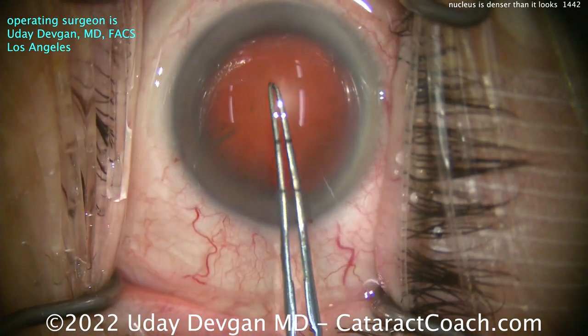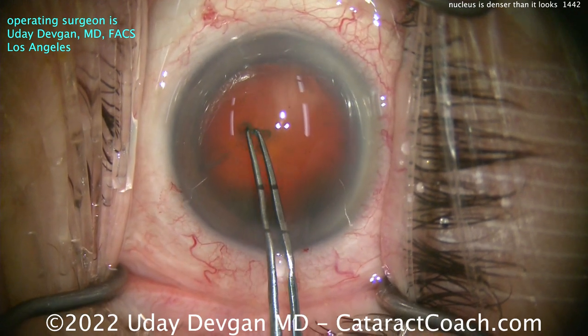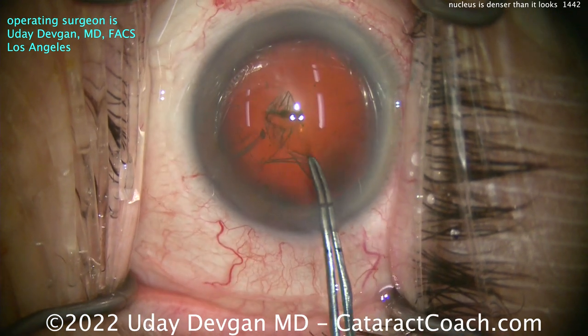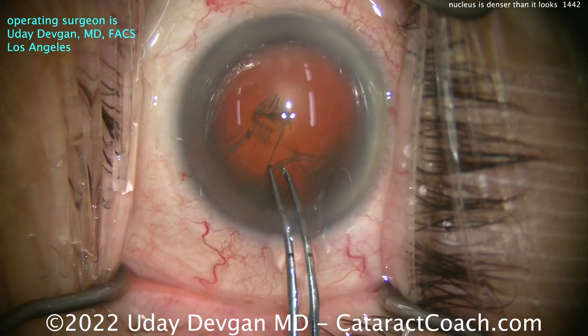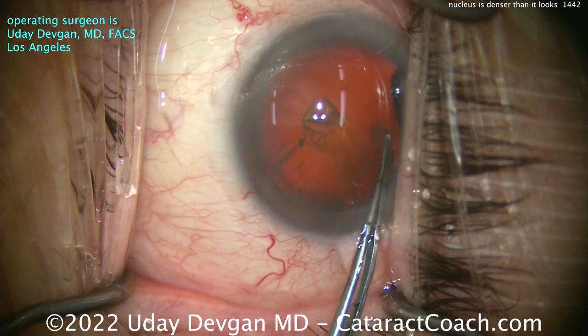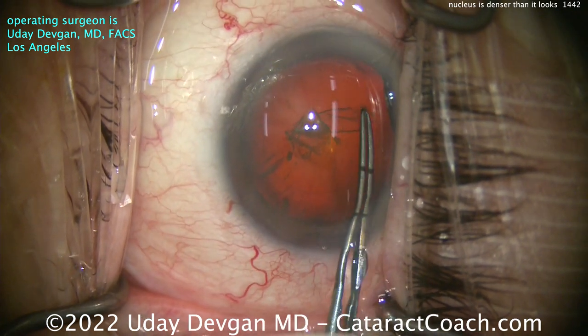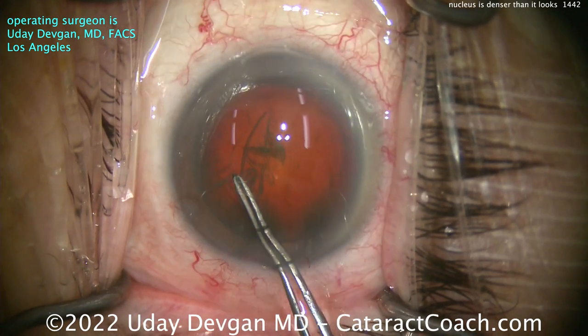There are a couple of little cortical spokes, but nothing too dense. So we'll start off doing our capsulorhexis using forceps, aiming for about a 5 to 5.5 millimeter capsulorrhexis. Everything is anticipated to be just about normal. But that's the beauty of cataract surgery — you kind of never know. Every case is a little bit different.